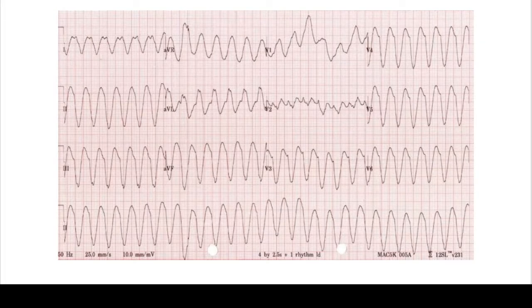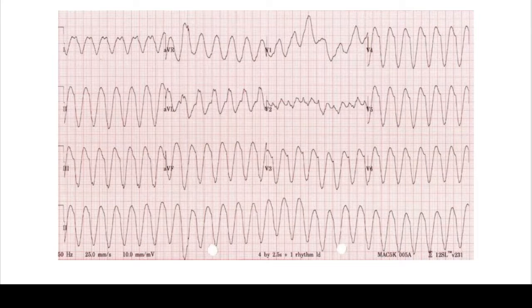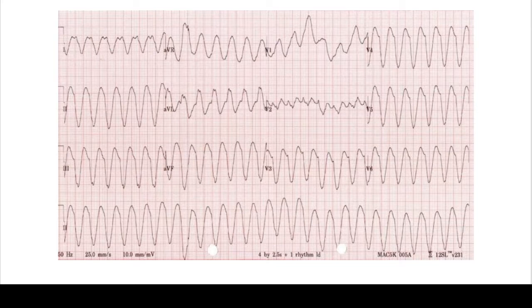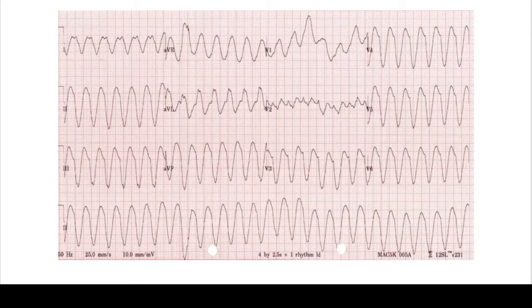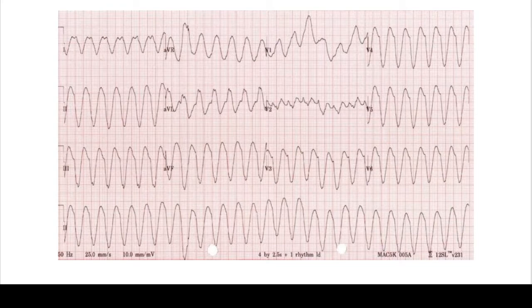Let's first look at an example of VT. Looking here, looking at the bottom rhythm strip of lead II, we see that this is a monomorphic wide complex tachycardia. You just see these big QRS complexes going up and down, up and down. So this is a classic VT. We see that it's regular, it's wide complex. So this is a VT.